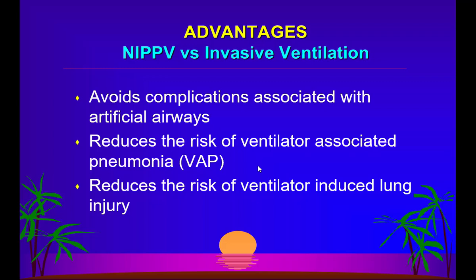Here again, I want to give you a word of caution. Like in patients of ARDS, you are using non-invasive ventilation. And if you are dragging it on for a long time, then studies have shown that if you prolong non-invasive ventilation, ultimately the patient may have increased lung injury. So there is a problem here.